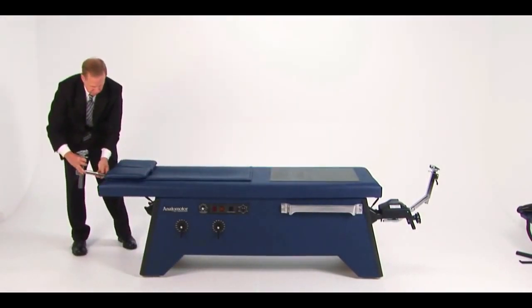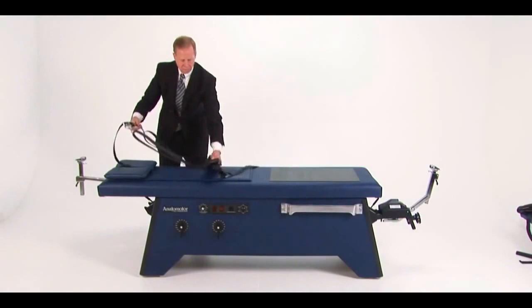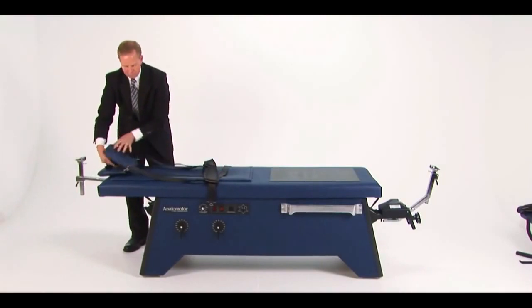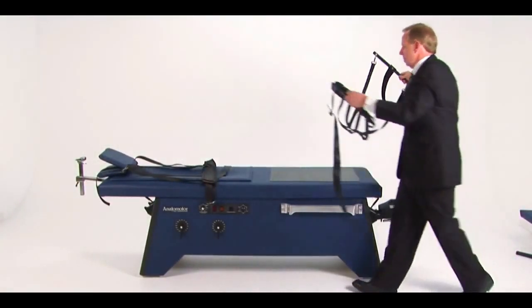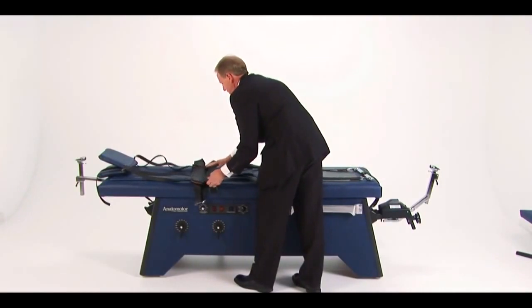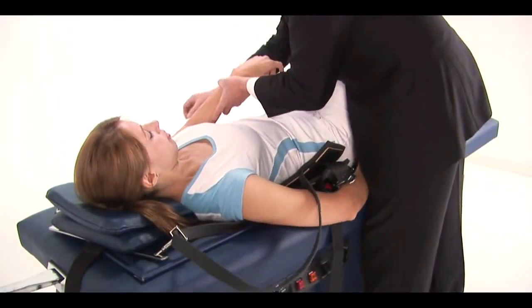For lumbar traction, which is directed primarily at the 4th and 5th lumbar vertebrae, you will use the iliac and thoracic harness belts. Place the thoracic harness on the upper half of the table. This counters the traction and keeps the patient from sliding. The iliac harness, the longer of the two, is placed on the bottom half of the table so that the belt is about 5 or 6 inches above the cutout section of the tabletop. Position the patient so that the base of the sacrum is 3 or 4 inches above the bottom cutout section.